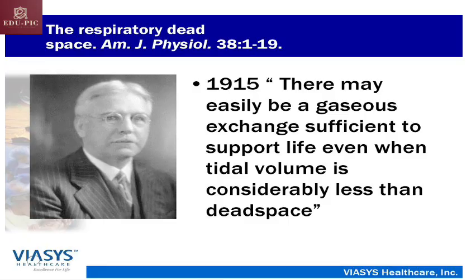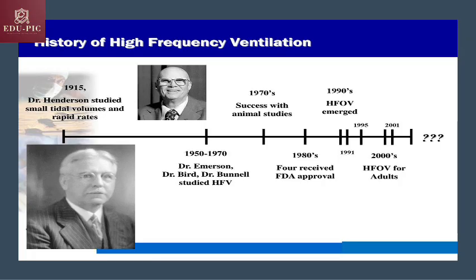The idea about high frequency ventilation started very early. In 1915, Dr. Henderson said that there may be easily gaseous exchange sufficient to support life even when tidal volume is considerably less than dead space. And as you can see here, this is a historical map for the progress of the idea of high frequency ventilation, which was started by Dr. Henderson in 1915 and ended at 2000 when the FDA approved the use of high frequency oscillatory ventilation for adults.